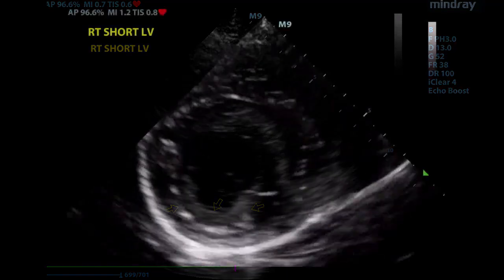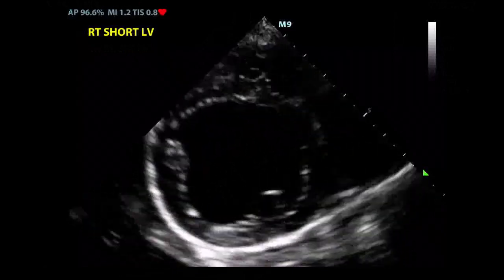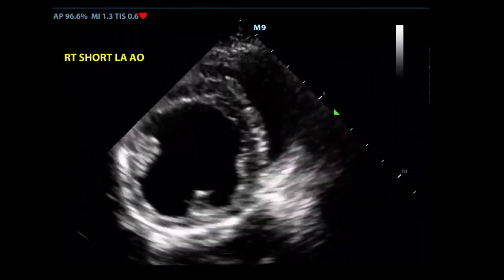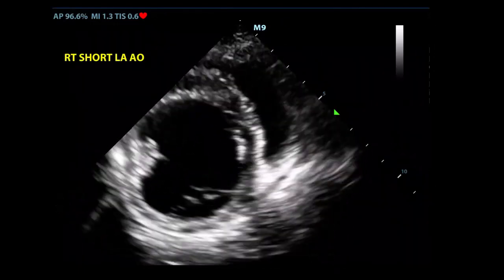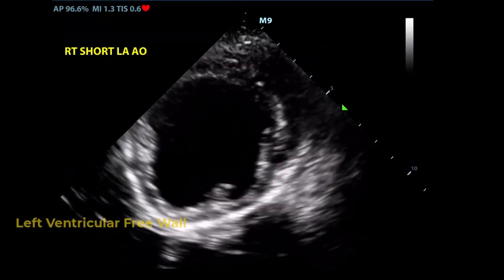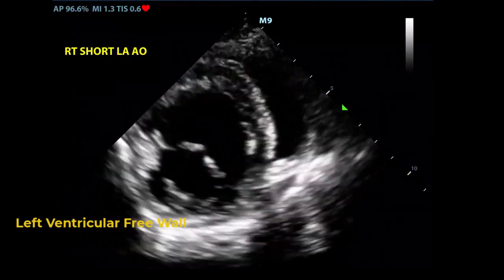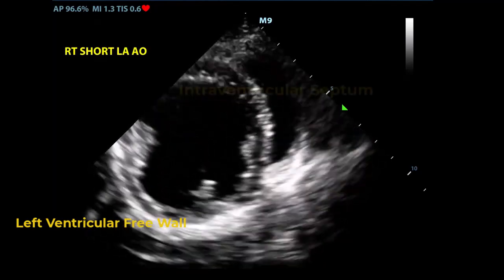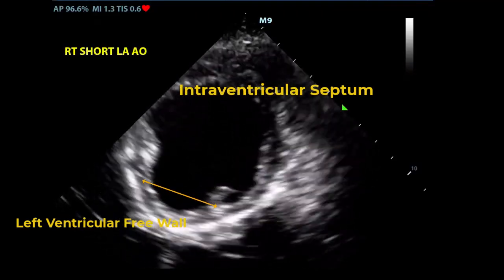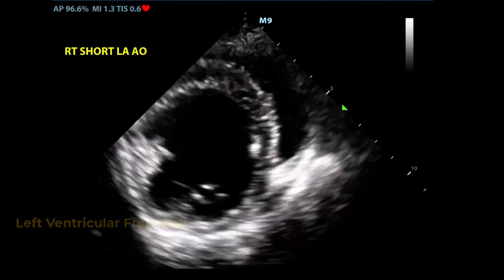In this two-dimensional video, the left ventricle appears to contract evenly. In this two-dimensional video, the left ventricular contraction is abnormal or uncoordinated. Muscle of the left ventricular free wall is hyperechoic, suggesting focal infarction or fibrosis of the muscle. The septum is contracting strongly, but the center and right side of the left ventricular free wall do not appear to be contracting.